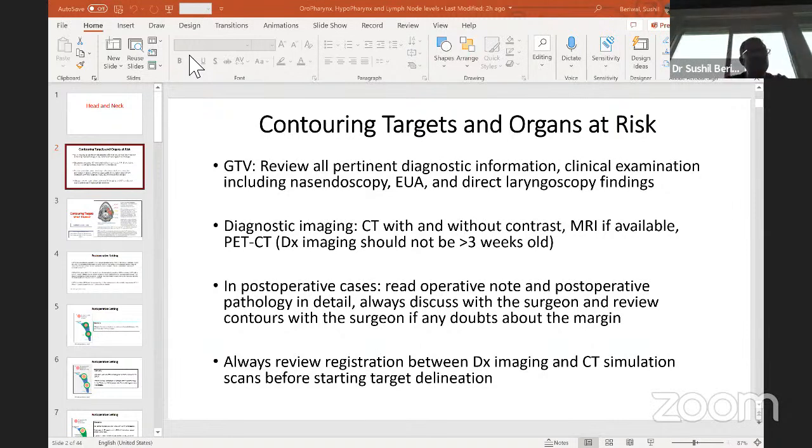So when you are defining CTV, the highest risk CTV for head and neck cancer, how much margin do you give from GTV to CTV? So please answer in the chat so I understand where we stand, and so we can go through these questions as we go through it. So how much margin from GTV to CTV for the 70 gray volume? That's the first question. Just be interactive and answer in the question and answer session.